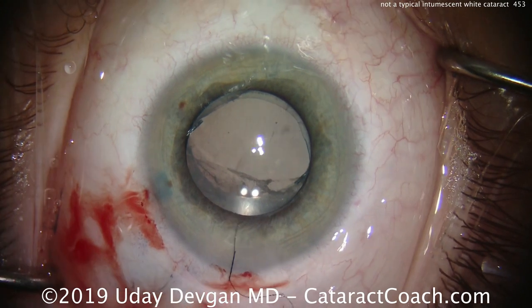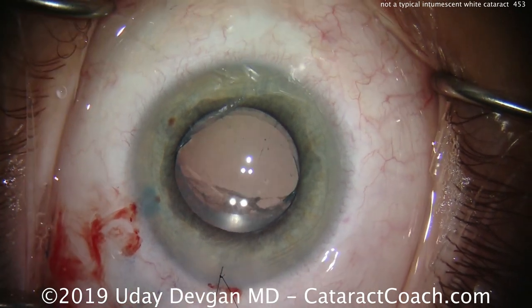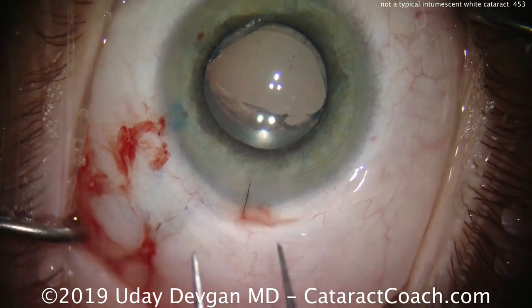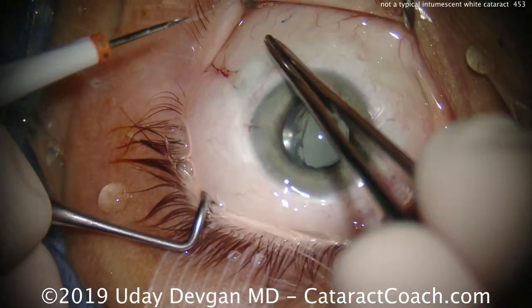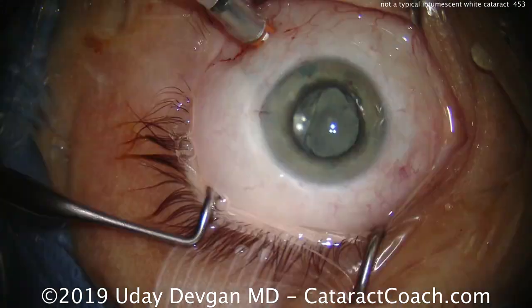We're going to suture up the main incision — I'll do this in fast-forward. It's important to suture this up because now we're going to proceed to pars plana vitrectomy. We'll also clean up that little bit of posterior capsule there to make it a little prettier behind the optic. That's all done — now it's time for my retina colleague.